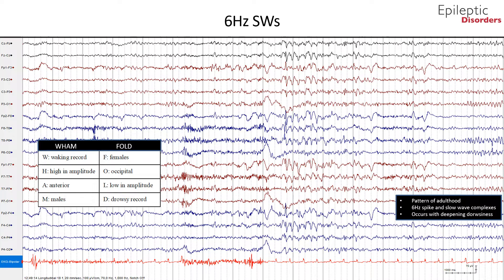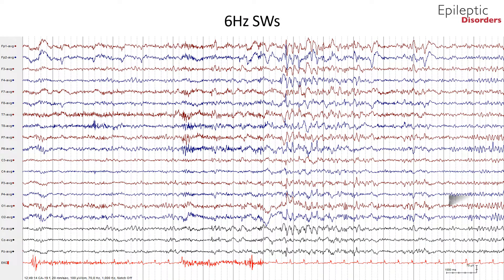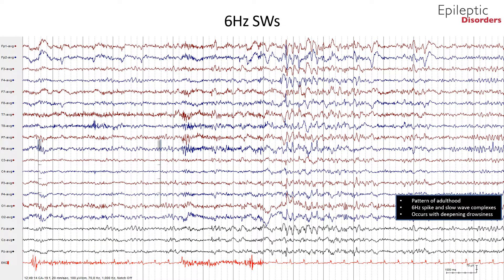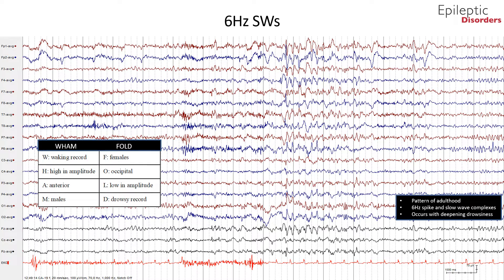This bipolar montage EEG outlined in the red circle shows 6 Hz spike and slow wave complexes in a 35-year-old male. Note the anterior location of the activity. This is an average montage showing the same EEG in a 35-year-old male patient. Note the high amplitude, 6 Hz spike and slow wave complex that appears to be maximal in the anterior regions as outlined by the red circle.